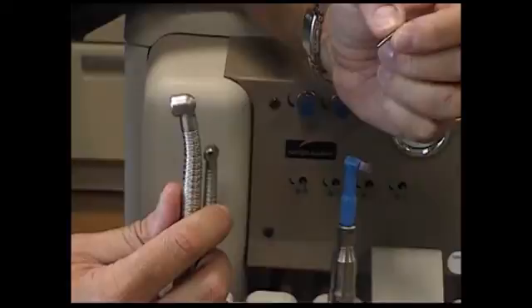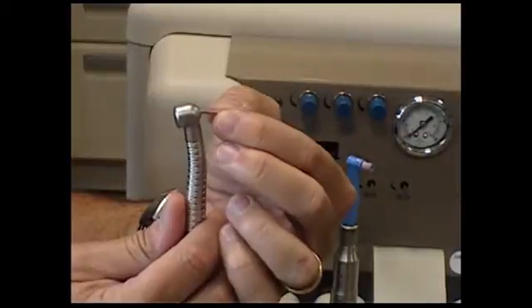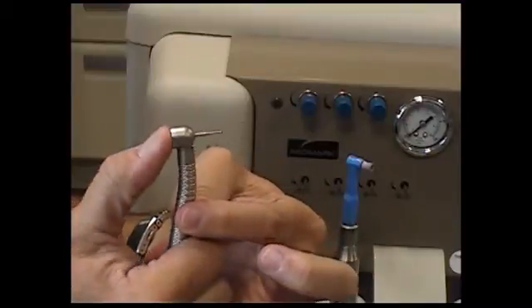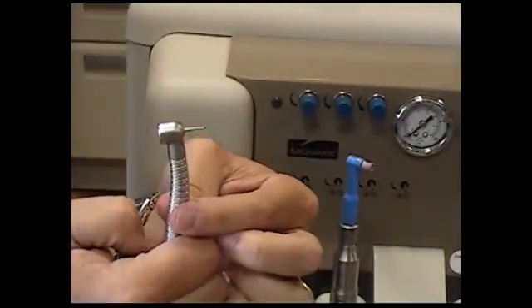Next, we put a burr in the high-speed head by taking the following steps. With the smooth edge of the burr facing toward the high-speed handpiece and the rough edge facing out, push the burr into the head. Once the burr has gone as far in as it can go, push the button on the back of the handpiece head firmly. While holding the button in, push the burr in as far as you can, then release the button.